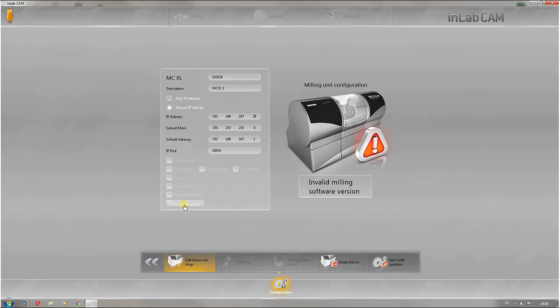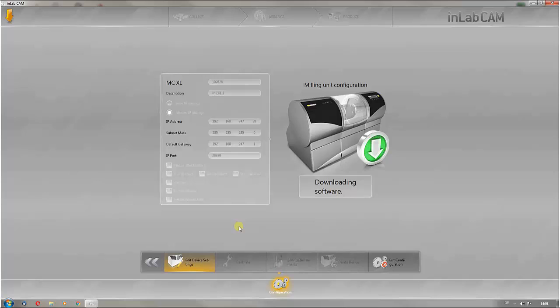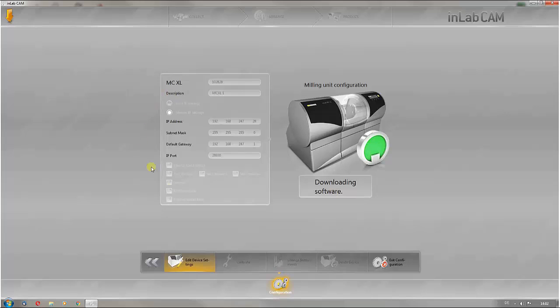The firmware will then be updated for the respective mill. In this overview field, you will find all the further information on the machine, in this case the InLab MCXL and the IP settings.